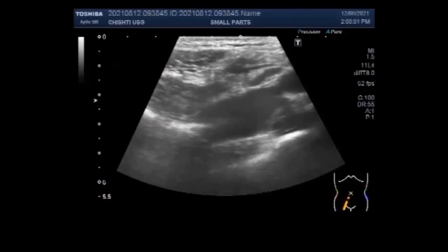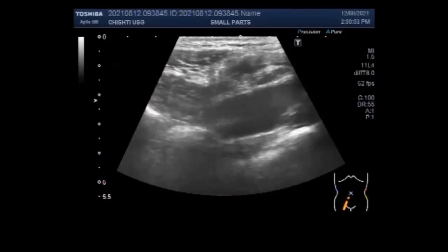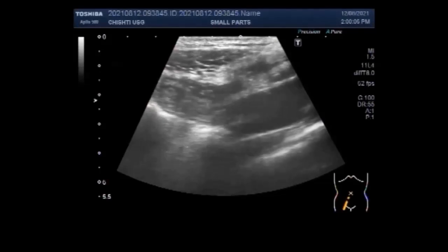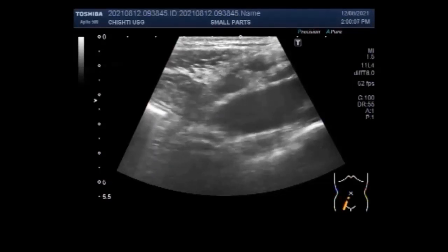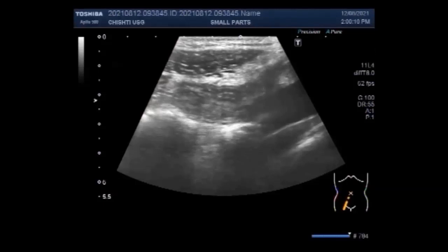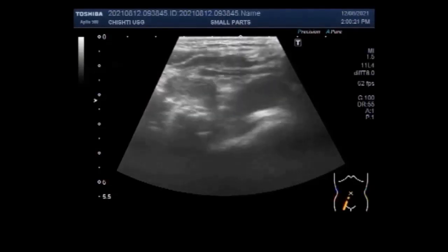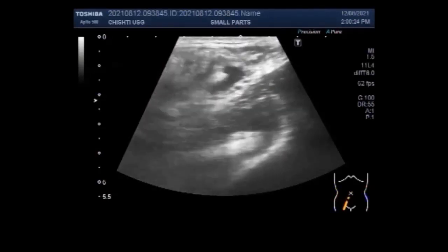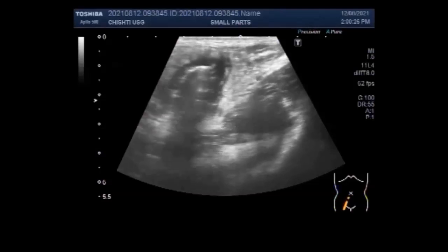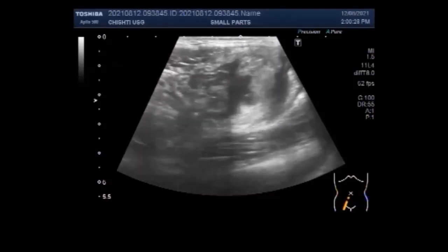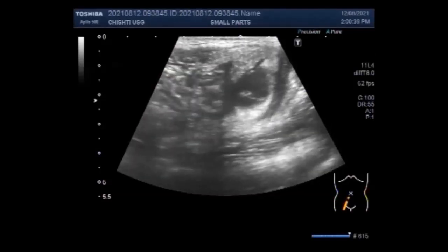By applying a high frequency probe — that is, a high power linear probe — you can see a tubular structure in the right iliaca fossa surrounded by a hypoechoic rim. This is a transverse view. This is the cecum, and now sweeping the probe around you will see the inflamed appendix. In this transverse view, you can see a small amount of fluid surrounding this tubular structure.